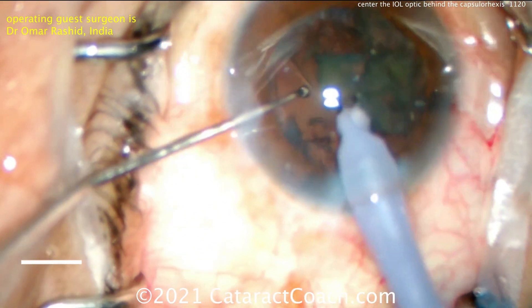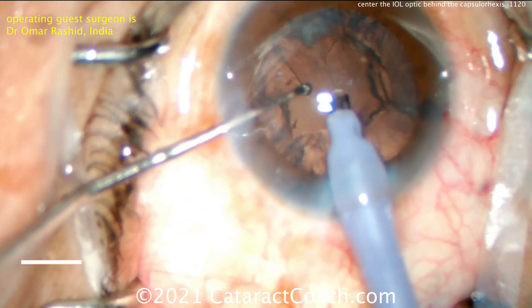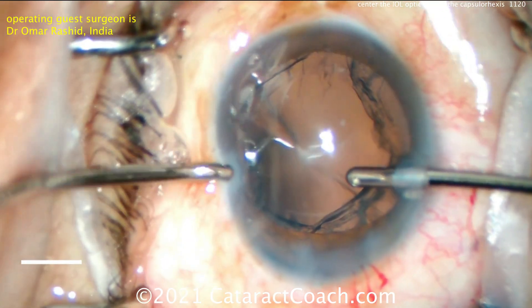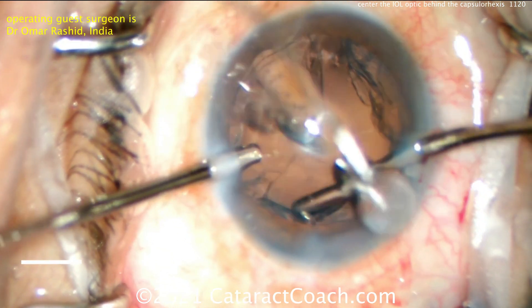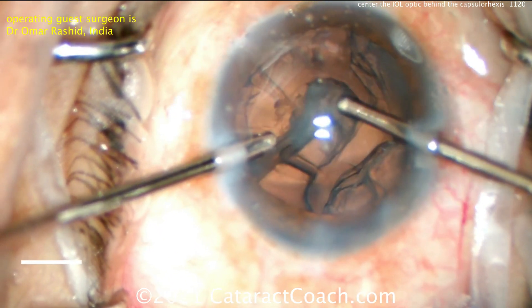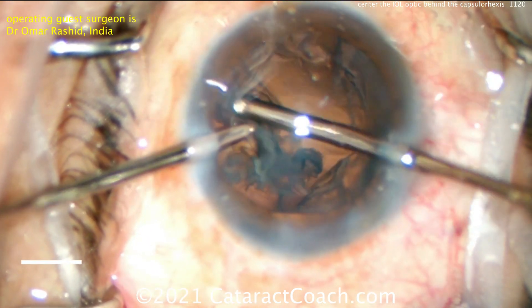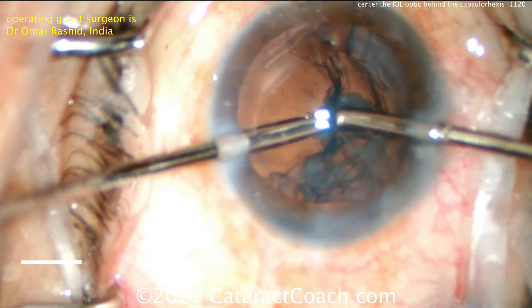Just center up that microscope a little bit more and get that cornea in the center of the operating field — that just takes practice and time. I'd get the rest of the cortex with the IA probe — good move, let's not risk anything. Using a bimanual technique, of course, two paracenteses at the beginning. A bimanual IA is very useful because you have great access — you can switch hands. The left hand has the infusion, the right hand has the aspirator, and the cortex can be removed quite nicely. Then the hands can be switched, giving you 360-degree access. It requires an extra incision — two paracenteses instead of just one — but in most eyes that should be of no consequence.